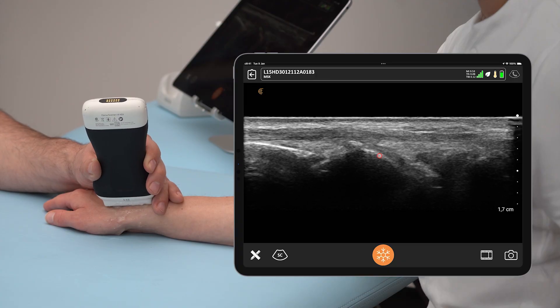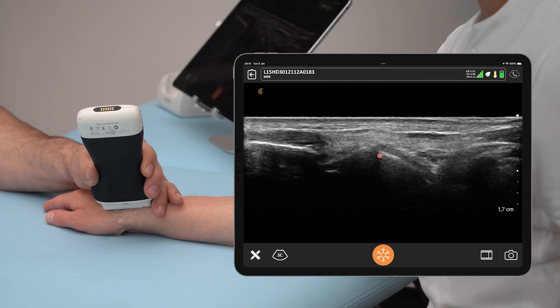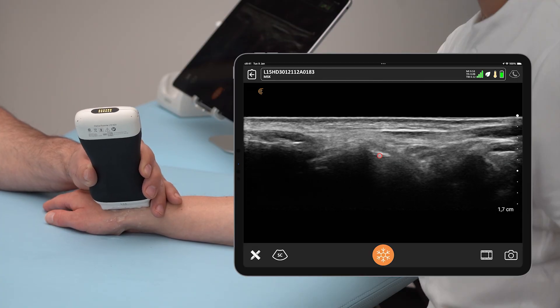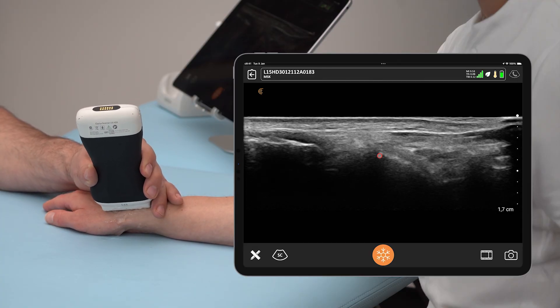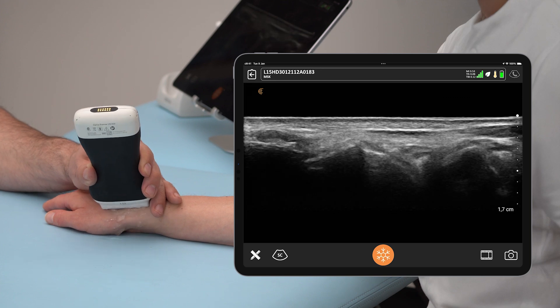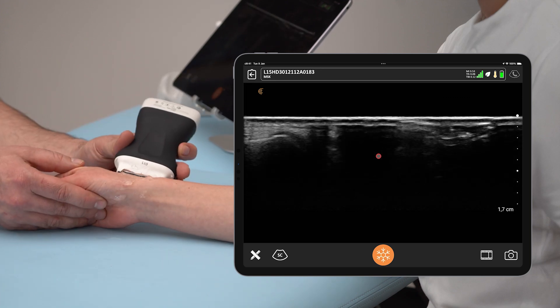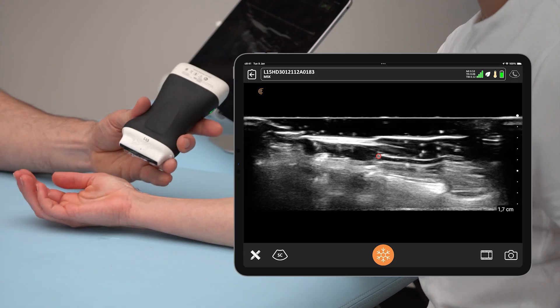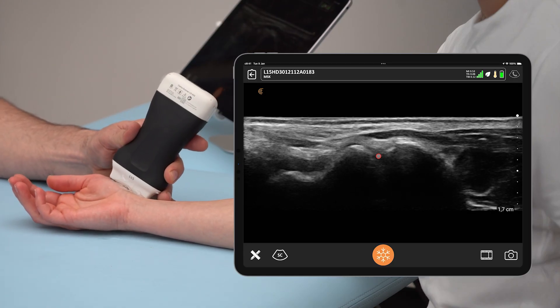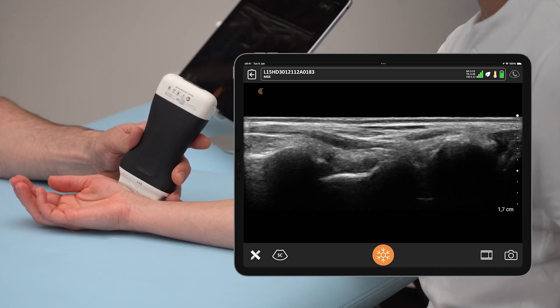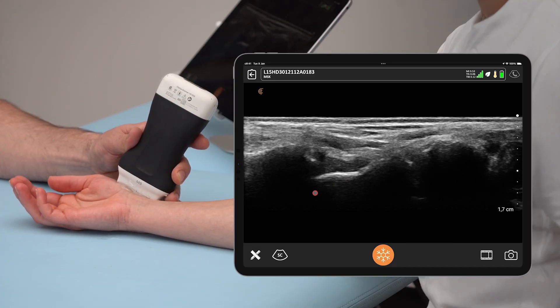We're going to scan not only in one spot — ultrasound is dynamic, so the sonographer slides with the transducer from medial to lateral in the dorsal aspect. After completing that, we will turn the patient's hand and then assess the palmar or volar aspect of the scaphoid bone.